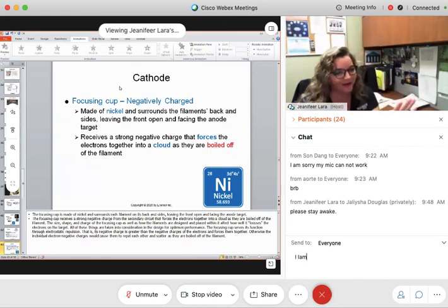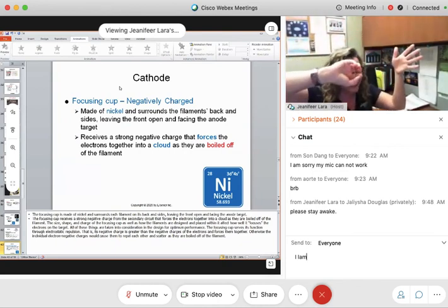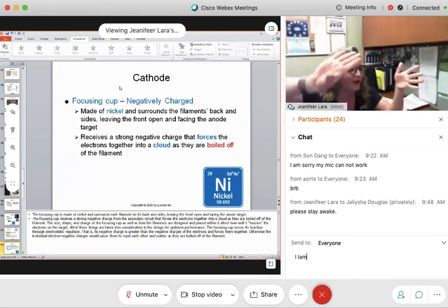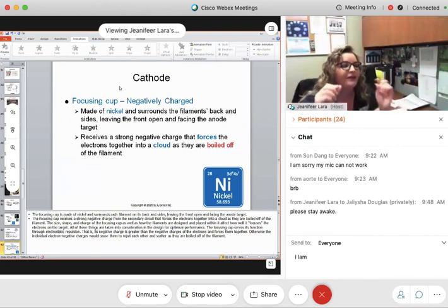Why don't we stop here? Please go back over anode. I am done with anode. I am done with protective housing. Unless you have a question, I am not going over anode again. I am going to finish cathode if it kills me, so that you're ready for Friday.